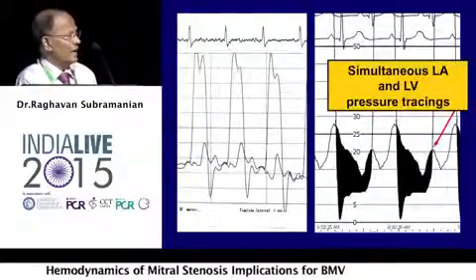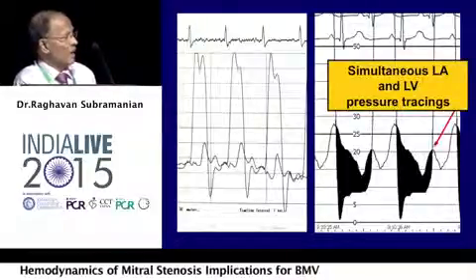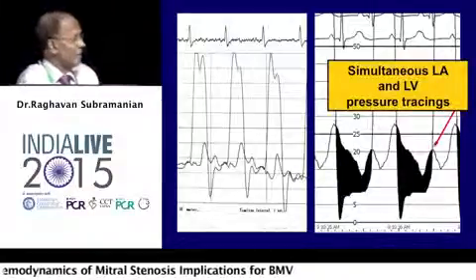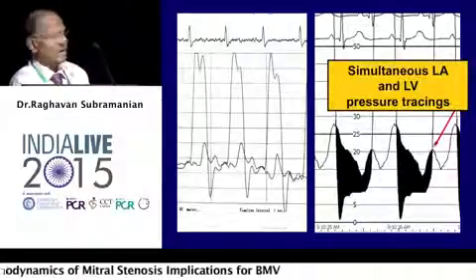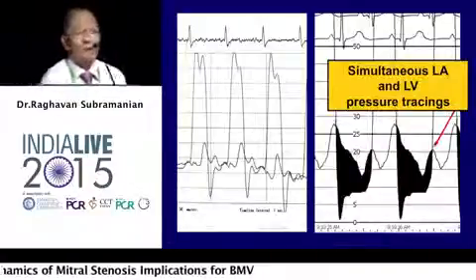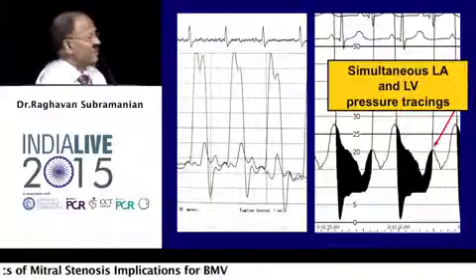You could measure the gradient at end diastole, which often shows by the sharp upstroke or by the vertical line drawn from the R wave. You could also measure the mean gradient, which represents the area of the total shaded area. This is a very important diagram for exam-going students.